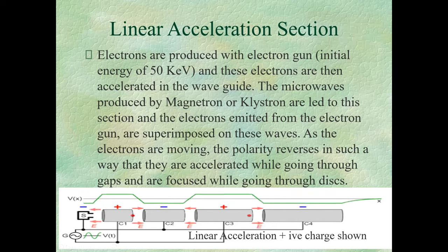Here again, when you do monthly QA and you take your field size image, for those of you who are not taking it for all the X-ray beams, please make sure that you take those field size images for all the X-ray beams, because when we are changing X-ray energies, in one of the pictures here you can see that this disk for X-ray energy is different. For different energies, different flattening filters come in front of the beam. So we have to make sure that the pencil beam is striking straight at the top of this. Sometimes if they are misaligned, the center of our beam is striking here and it's not striking on this area or on this area.